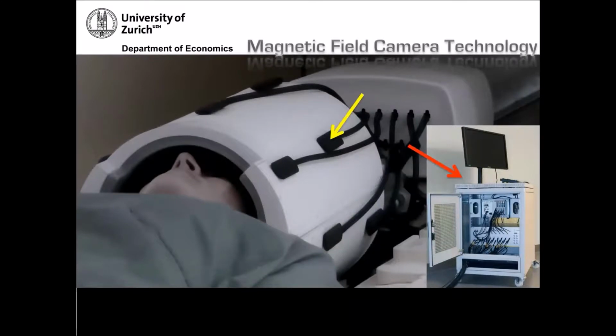The actual implementation that Skope sells, and the one that we bought, they call it the clip-on system. So the probes that you saw on the previous slide are housed in these little black rectangles, and it's a clip-on system in the sense that you clip it to whatever head coil you want to clip it to. So whatever you use for your measurements, it's a flexible installation. You can attach these probes to your regular setup. There are 16 probes, so you can fit up to 16 terms, so up to third order.